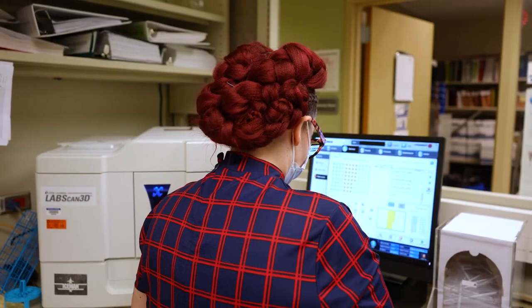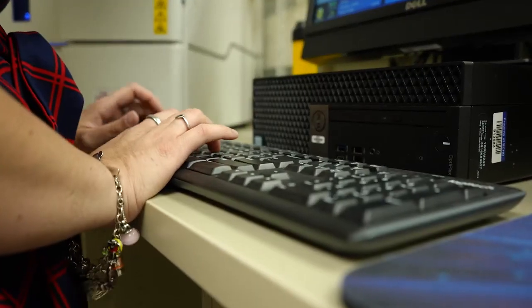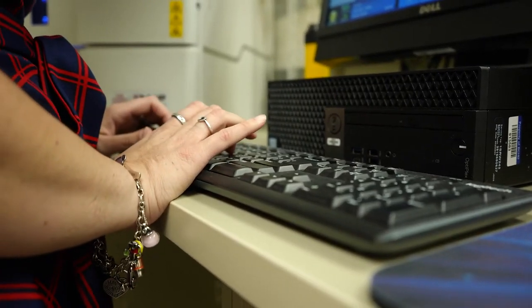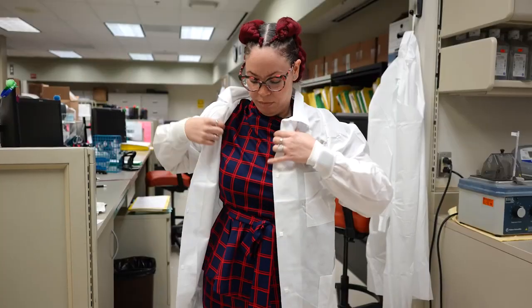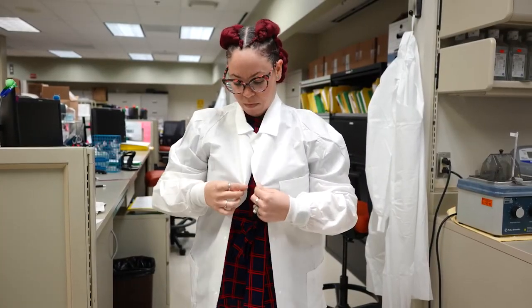We first started using the extended panel December 2020. Bridging the gap was somewhat complex. We didn't have as many specificities as the XPlex panel does now. So for example, we have our allele A*02:05. Beforehand on the expanded panel, we only could report an A2. We had several A2 alleles that we just had to report positives or negatives for every single one. Now that we have the A*02:05 on the extended panel, we can just report specifically A*02:05.